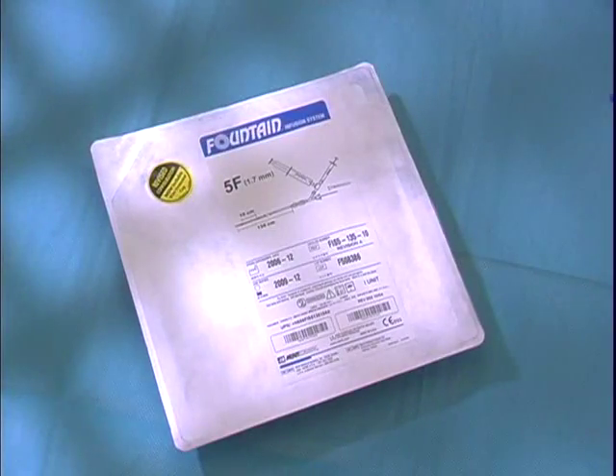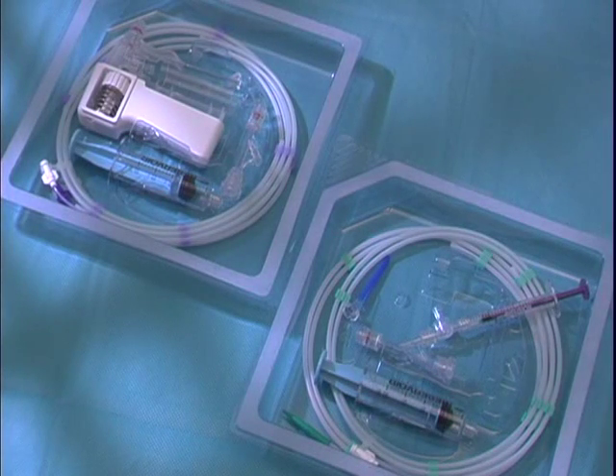The setup and use of the Fountain system is straightforward and very simple to do. Both the 4 French and 5 French Fountain catheters can be placed over a standard 0.035 diagnostic guide wire when placing the catheter within the patient's vasculature system.